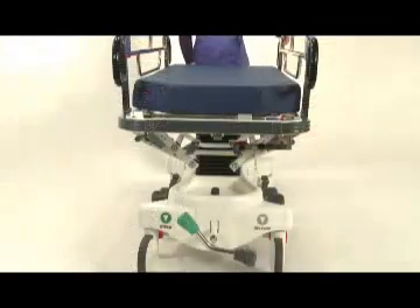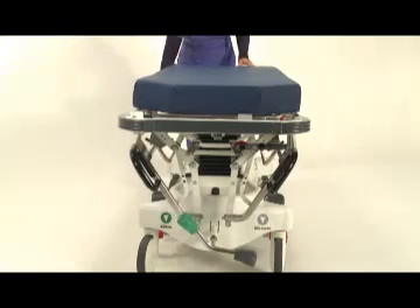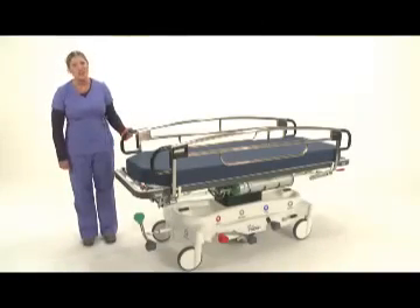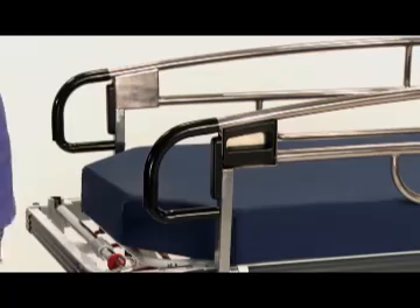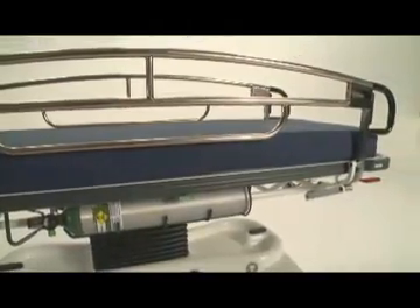With the side rails now lowered in their tuck away position, a zero transfer gap is achieved, ideal for transferring a patient from one platform to another. Another key feature is the integrated push-pull handles — there's no need to spend additional money for pop-up handle options. Pedego side rails are easy to clean and keep clean as there are few places for fluid and bacteria to accumulate. Available in stainless steel or Covero antimicrobial copper alloy.